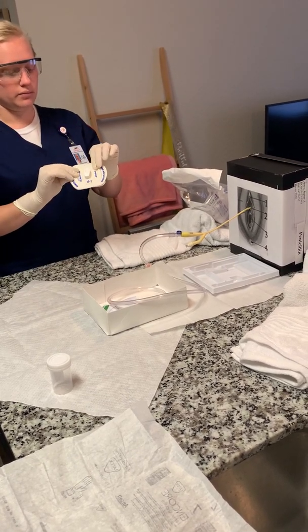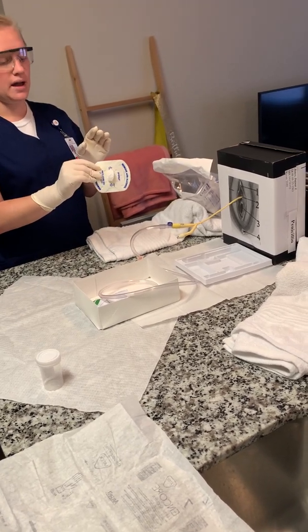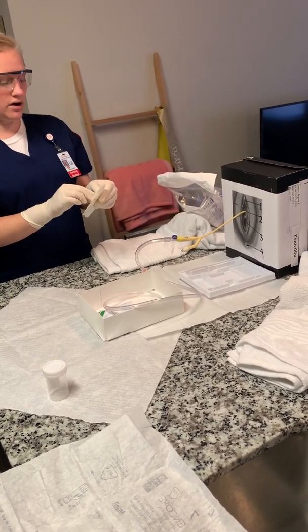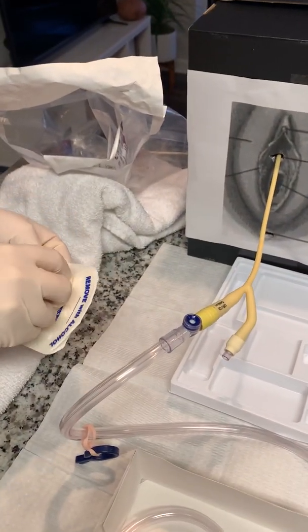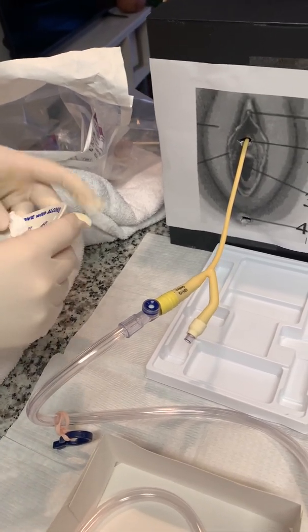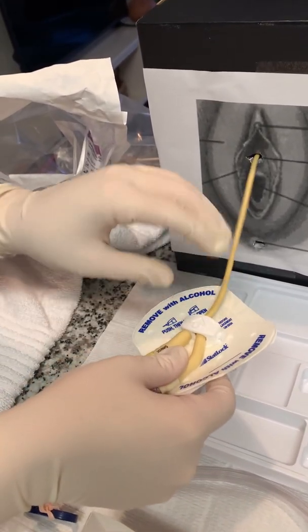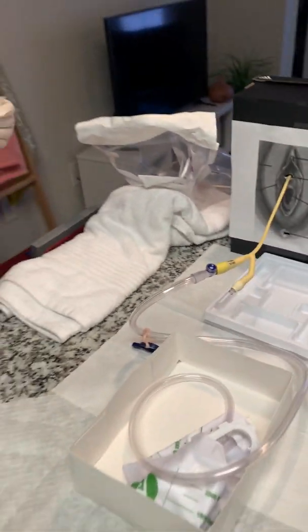And then I want to place the stat lock on the upper inner thigh, and I want to make sure that I leave a little bit of slack so there's no tension on the urethra. So this is how I'm going to show you how I would put the stat lock in. So I need to open it. Then I would place it like this and close it, and then I'm just going to take it off for now.